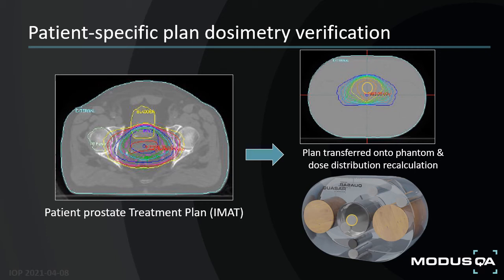In an ideal situation, the dose distribution between the two plans would be identical. However, this is generally not the case, as there is a slight difference between the two distributions, which would then inform the physicists that slight adjustments are necessary.